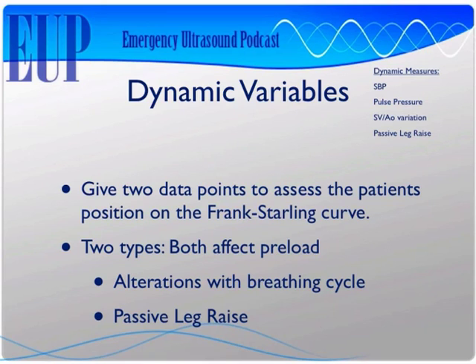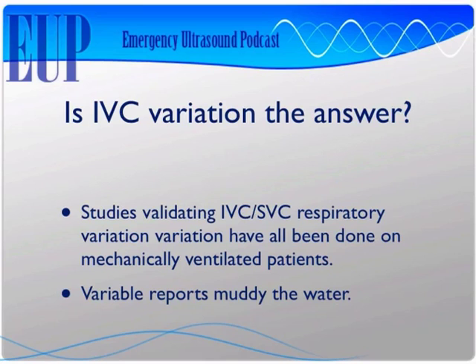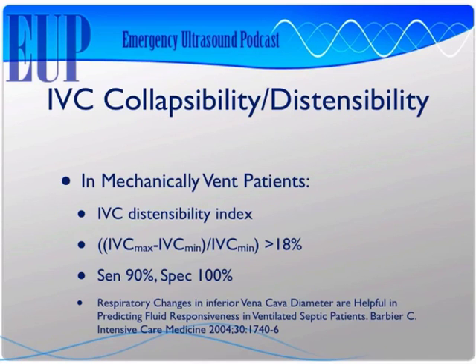So this really gives us a little bit more understanding about where the heart is sitting on that Frank-Starling curve. So IVC variation, is it the answer? Well, there's actually been some studies that show that IVC and SVC respiratory variation are pretty helpful. The problem is they're really only in mechanically ventilated patients, and there hasn't been much done in spontaneous breathing patients that I can really hang my hat on. So the reports are sort of muddy in the water, and let's dive into this a little bit.